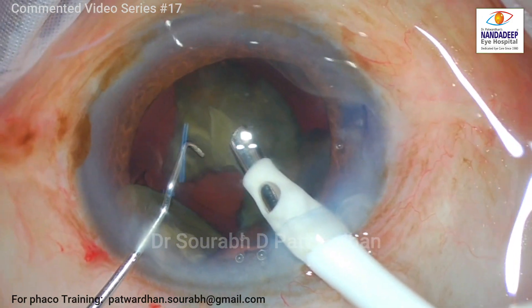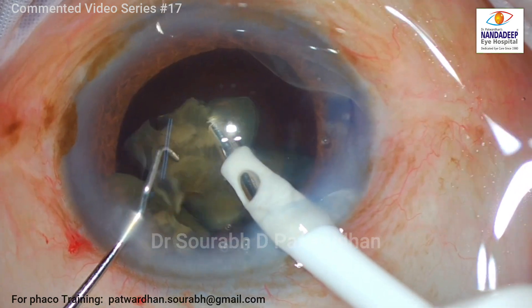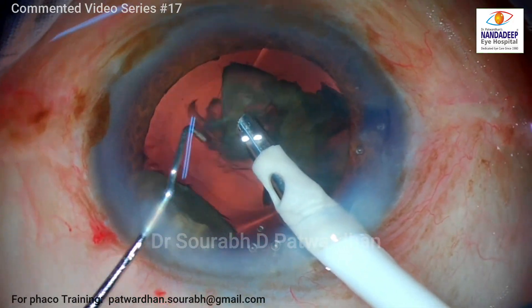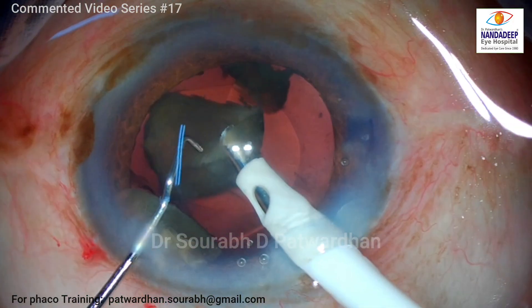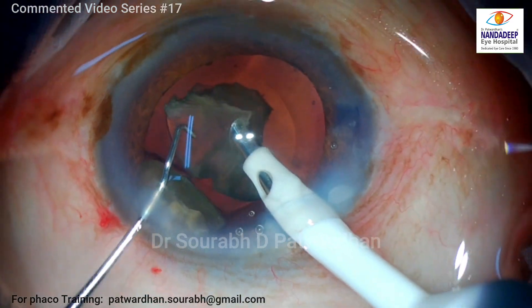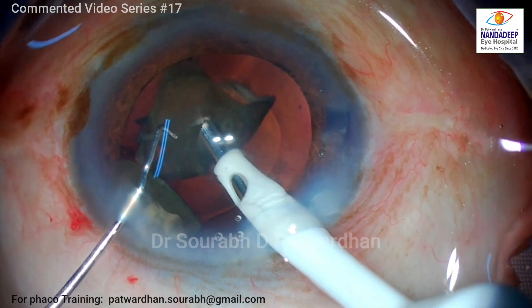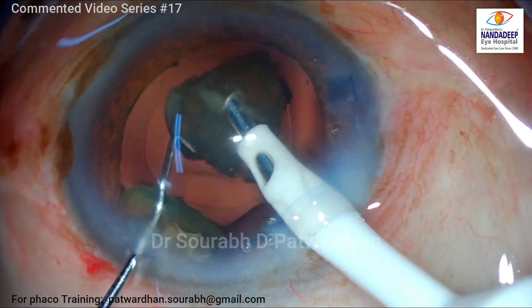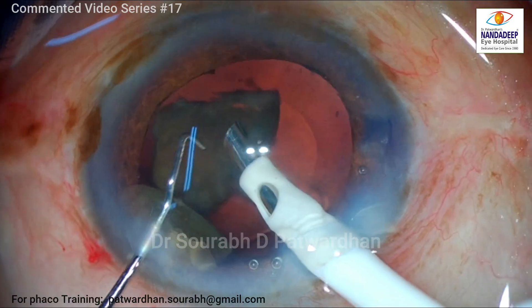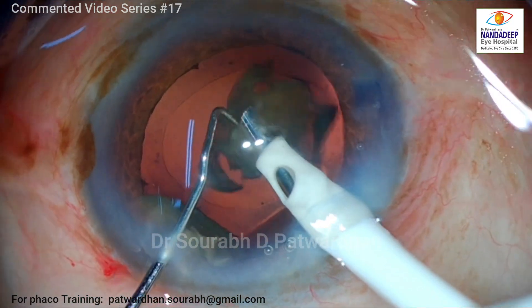So far it's going well. For the remaining pieces I have reduced the vacuum a little bit so that the anterior chamber remains even more steady. I shifted to retro-illumination mode to check the posterior capsule very carefully for the last piece. As I continue using this machine I am becoming more comfortable with its response, and I think I have found the right parameters for this case. Of course over time when you start using a new machine you have to keep adjusting your settings.